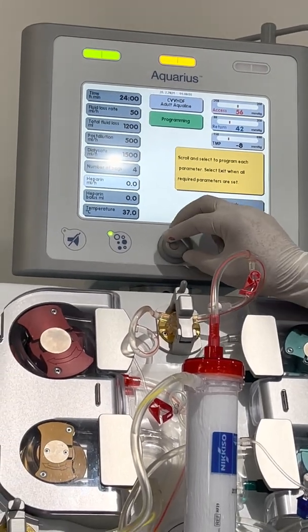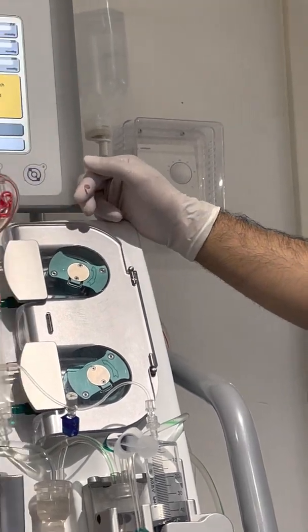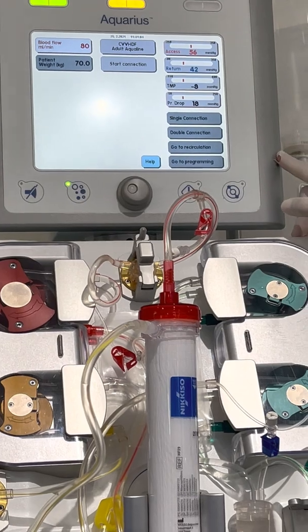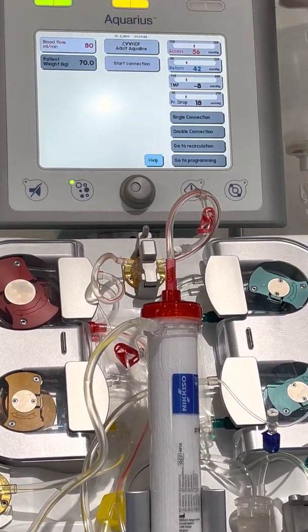So heparin is 0. If you have heparin, I will just adjust that. If you're going to put heparin, then just set it. So that's it. This is the time you're going to connect: double connection or single connection. Blood flow. So that's it.